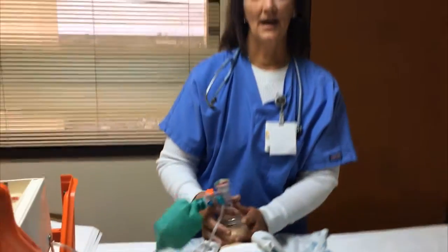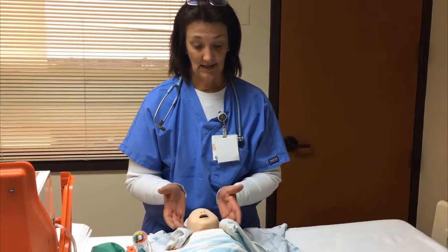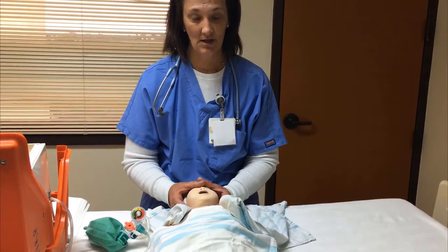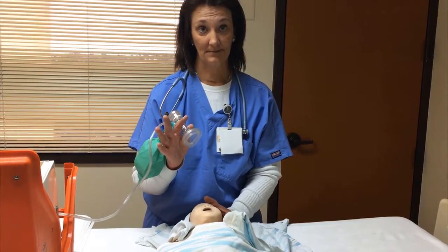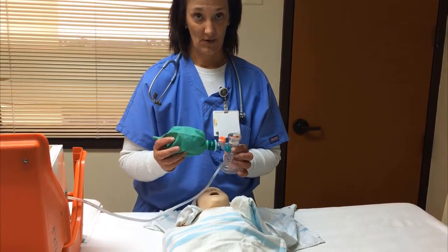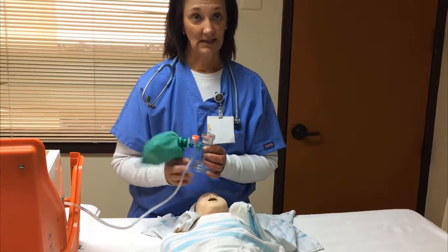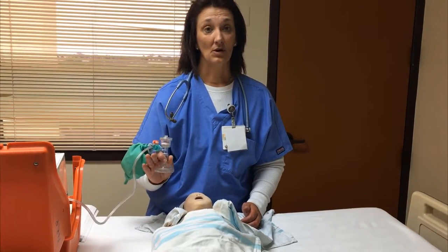The reason why I used a two-handed technique is because with the two-handed technique, we can actually thrust the baby's jaw forward in order to open the airway to ensure that we're delivering the PEEP properly. Now, with CPAP, the highest level of PEEP we want to go up to is 8 centimeters of water pressure. We do not want to give any more than that, particularly in preterm infants, because it can cause a pneumothorax.